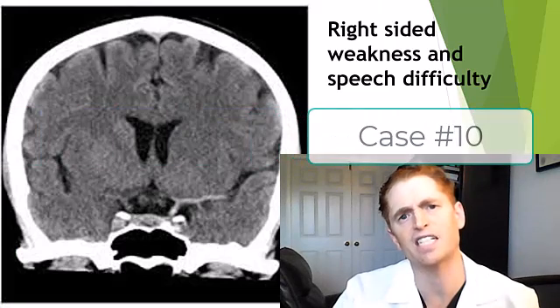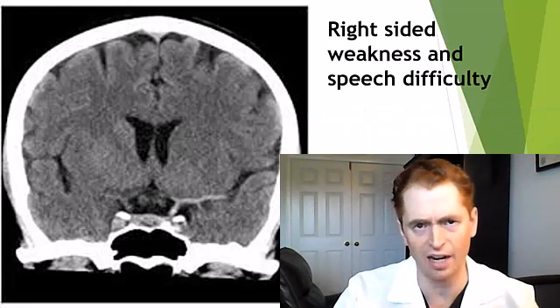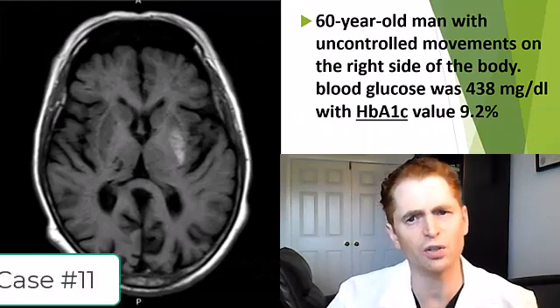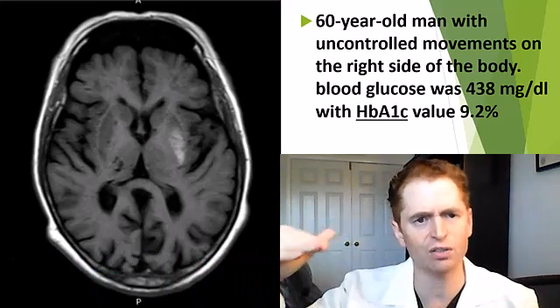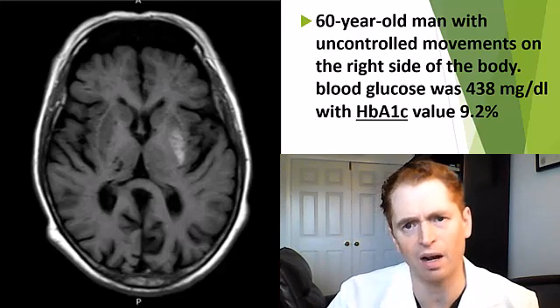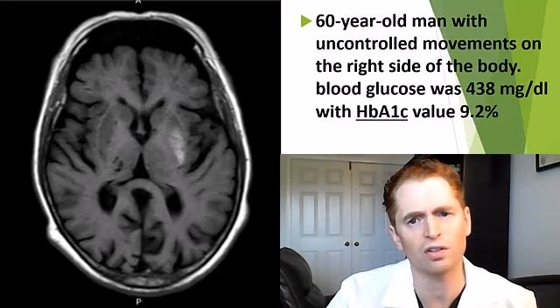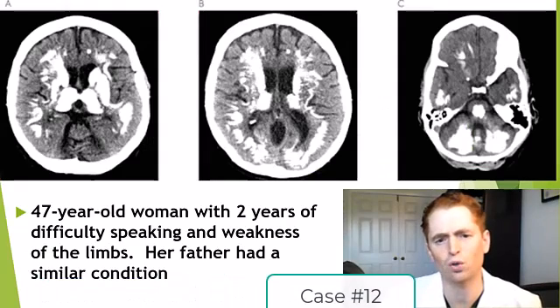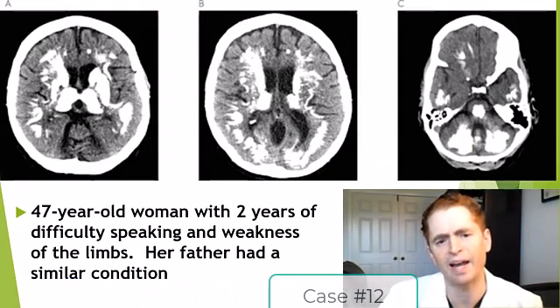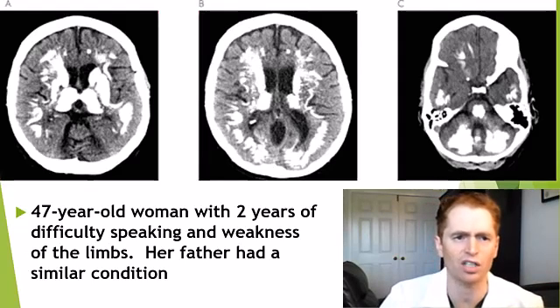Right-sided weakness and speech difficulty — this is a coronal image of a CAT scan; no contrast dye was given. We have a 60-year-old man with uncontrolled movements on the right side of the body. This is an axial T1 MRI with no gadolinium contrast. Of note, blood glucose was 438 and hemoglobin A1C was elevated at 9.2%. A 47-year-old woman with two years of difficulty speaking and weakness of the limbs — of note, her father had a similar condition. These are axial images of a CAT scan without contrast.